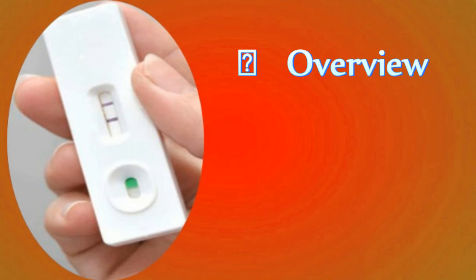The HCG appears soon after conception. Its level rises with the progression in the pregnancy developmental stages. Thus, HCG acts as an excellent marker for the detection of pregnancy.